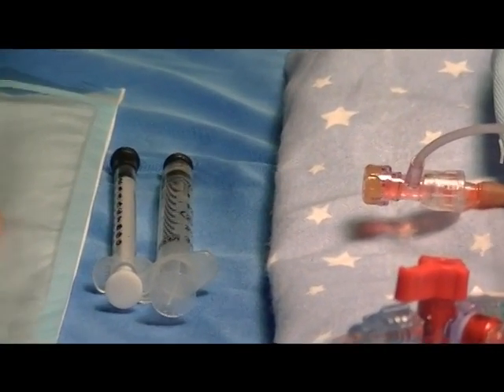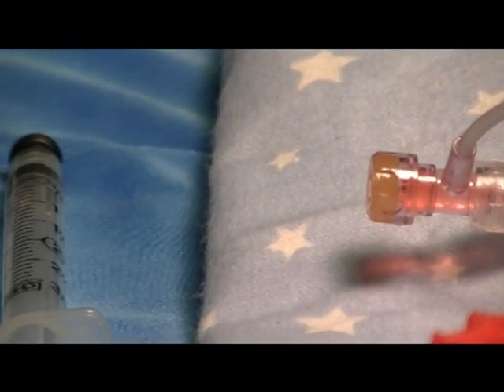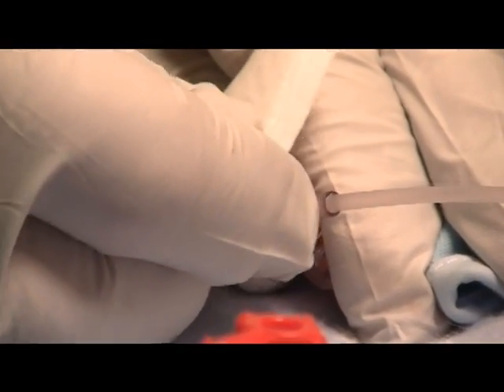The first thing you do is remove the prep material and appropriately prep the split septum T connector according to your hospital's policy and procedure.